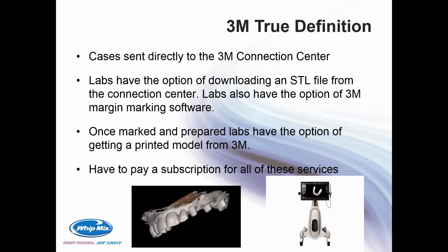And then one other thing to note with 3M, if you do have a doc reaching out to you asking you questions: it is one of the only scanners, I think there's one or two others, that does require a spray in the mouth, so the patient will have to be sprayed.